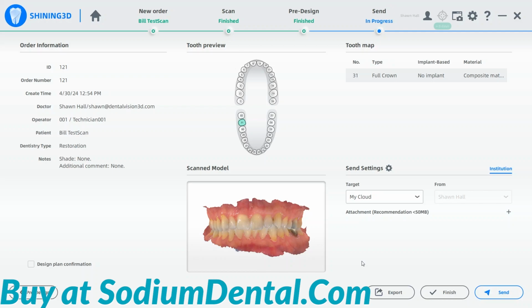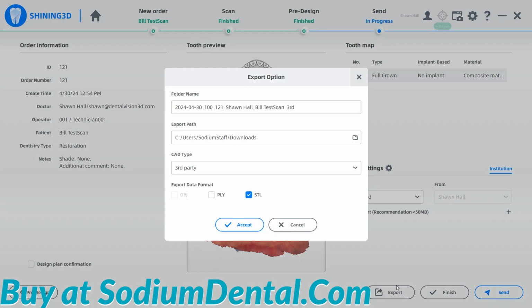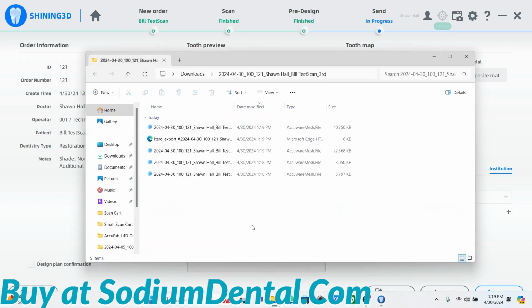If, for instance, your lab does not participate in the Shining Cloud or has their own portal for you submitting impressions, click the Export button, and generally choosing the third-party export and hitting Accept will provide you with all the digital impression files that you can easily upload to your lab's website portal or email to them if that's what they prefer. The folder with the files will automatically pop up. You can simply drag these into an email to send off to your lab or upload to their secure portal if they do not want to join the free cloud.